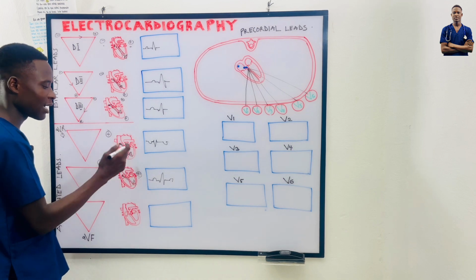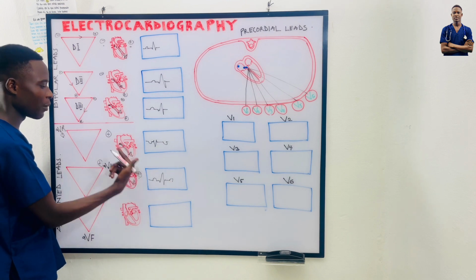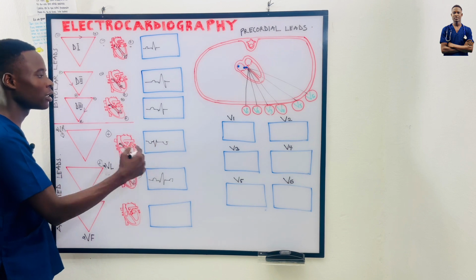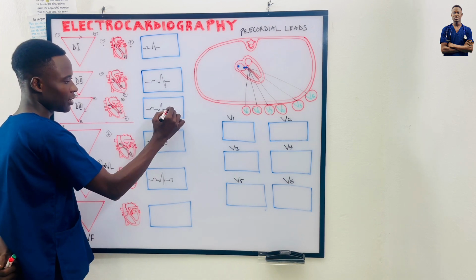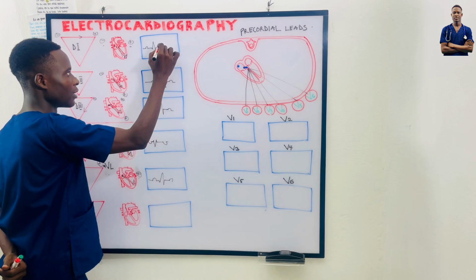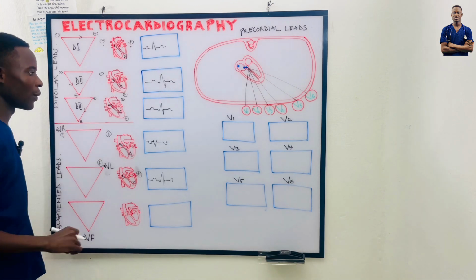And you can remember I said when a negative vector moves towards a positive electrode, it gives us a negative reading from our previous video. So this is actually giving a positive, and then this is giving a positive T. Do you understand? So that's our T waves.